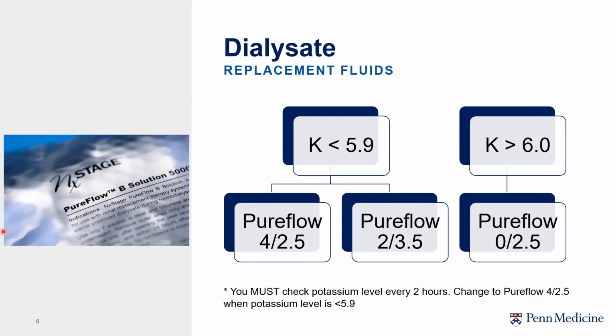So the higher the potassium level in our blood, we want to give dialysate with lower potassium, because again, with that lower concentration, we're hoping some of that higher concentration from the blood comes out into the dialysate and then is carried out of the body. It's the way that we maintain our K, our potassium, as we're doing dialysis.